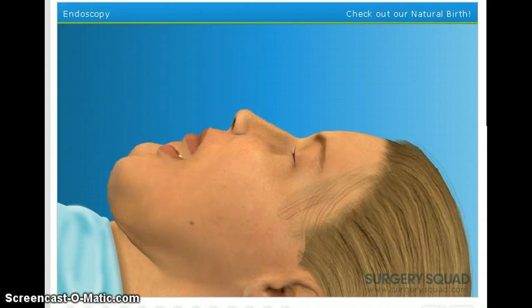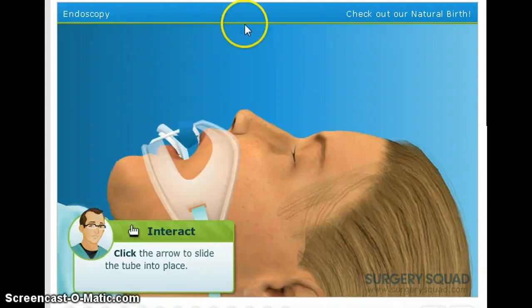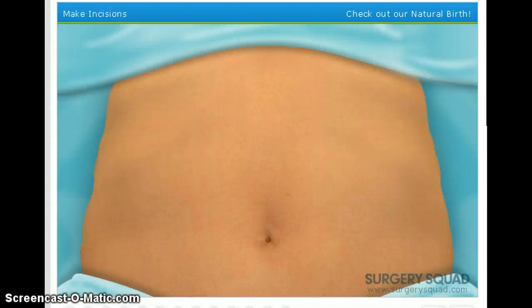From here, we'll place an endotracheal tube down the patient's throat. You're up. See if you can get the tube into place. Great work. This tube is then connected to a respirator. The patient is ready to go. Now we can begin our laparoscopic procedure.